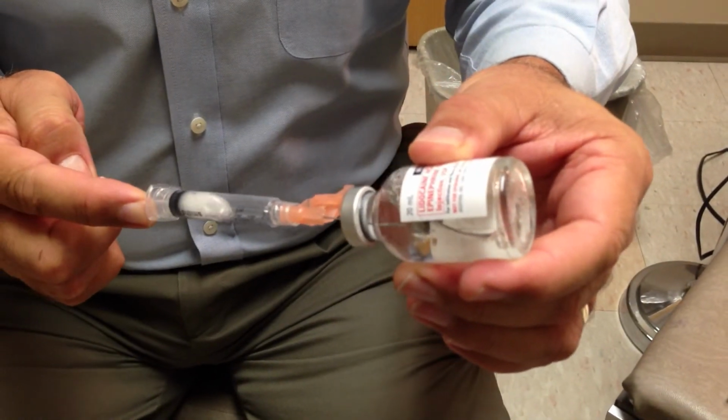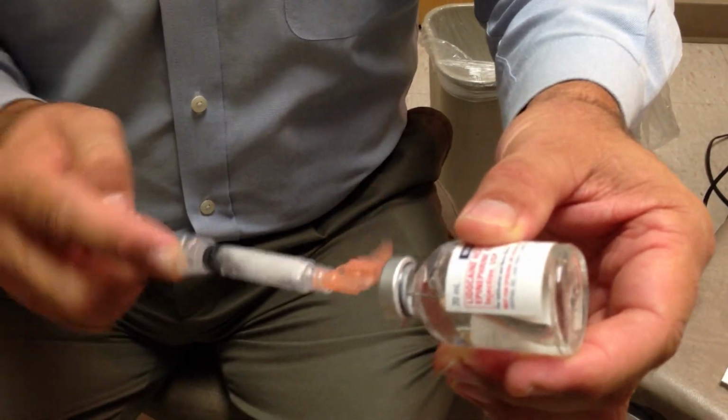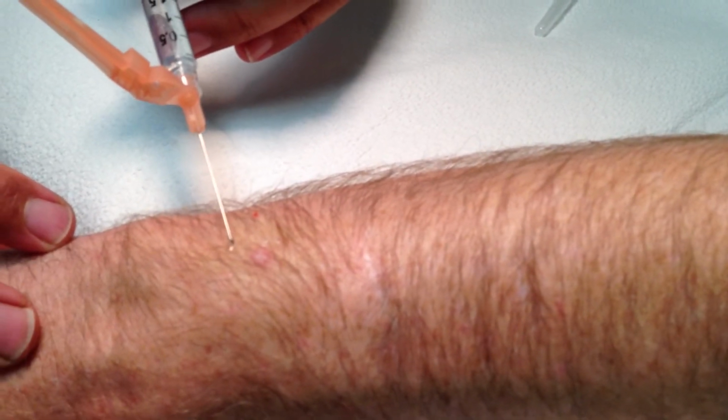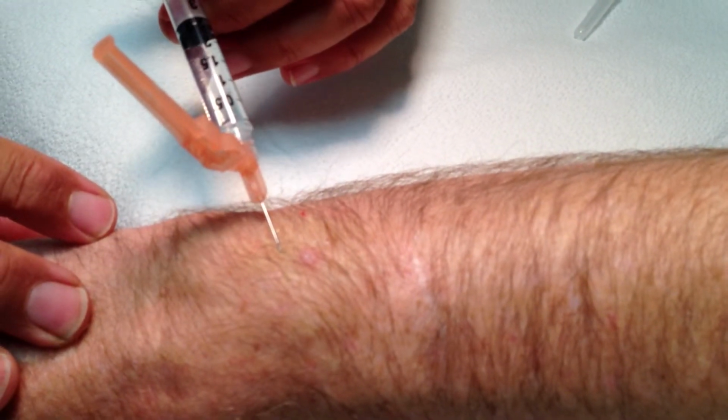This bottle is now contaminated and should never be used on anyone else. It will be discarded because this needle entered his skin and it has biological material from him, which hopefully doesn't have any viruses in it, but we just would never use that bottle on anyone else. We will be discarding that.